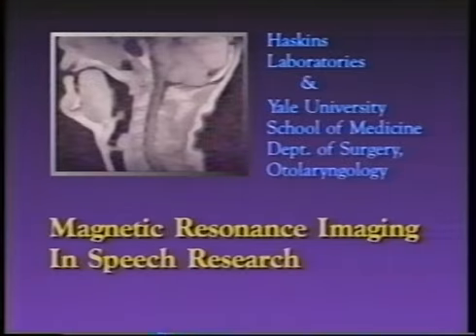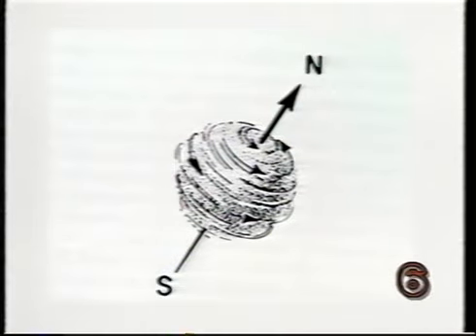The application of magnetic resonance imaging to the field of diagnostic medicine has been heralded as potentially the most important achievement since the discovery of X-rays. Until the discovery of MRI, the only methods of acquiring images from inside the human body involved the use of ionizing radiation, radioactive isotopes, or ultrasound waves. MRI uses magnetic fields, radio waves, and computers to create highly detailed anatomical images.